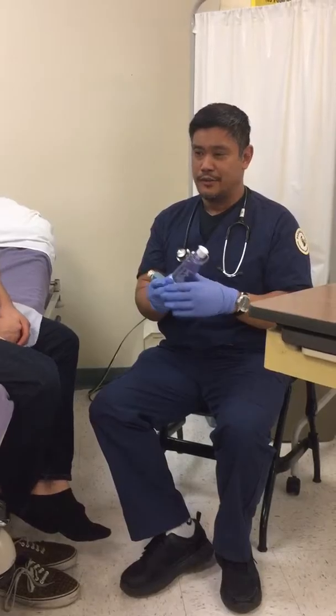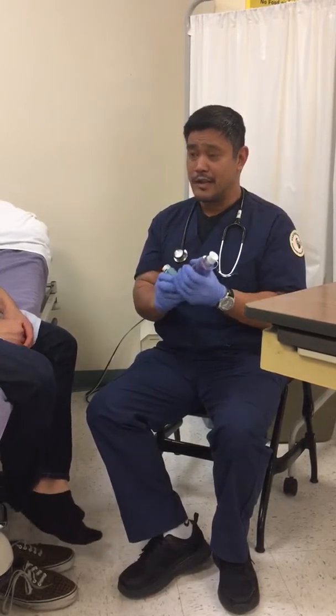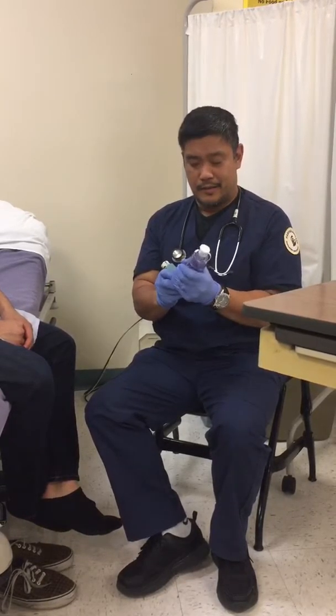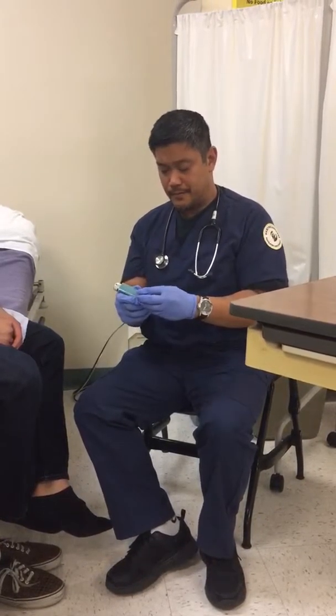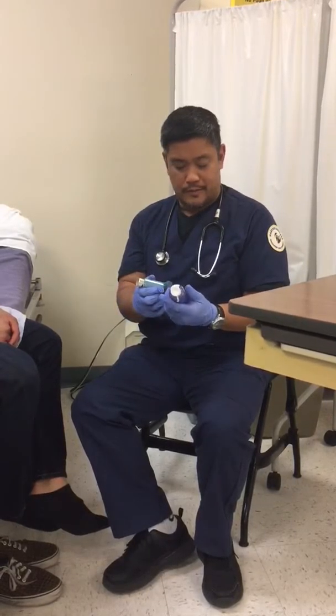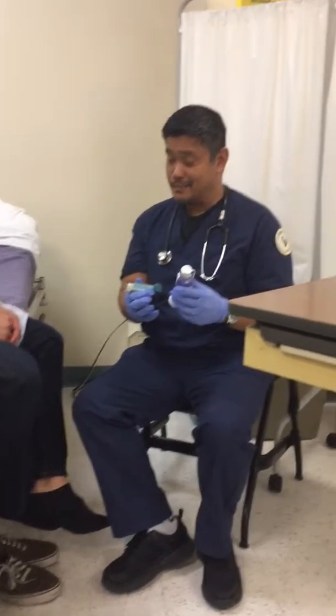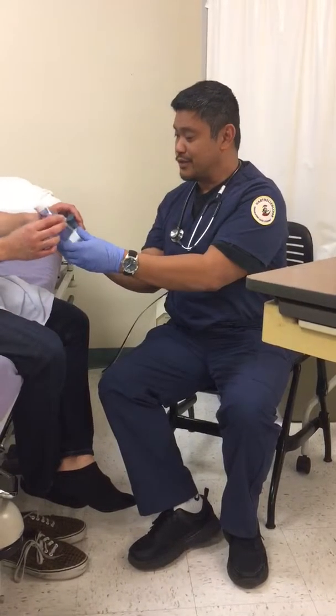So when you're out on the job or exercising and you feel that tightness and that attack coming on, just have this with you. It's really important. Ideally both devices, ready for you to use. So I'm going to pull this apart, and if you can show me, just to make sure everything is understood, and in case I missed anything, you can tell me exactly what I told you.